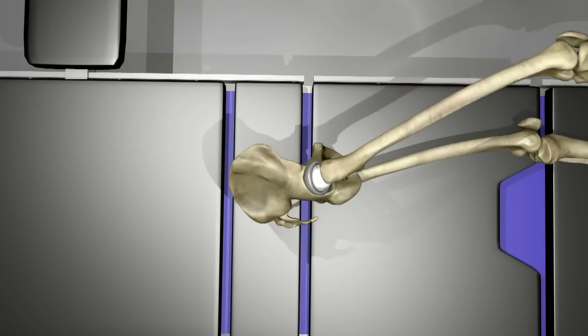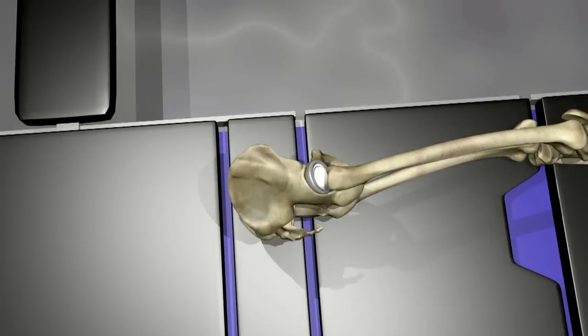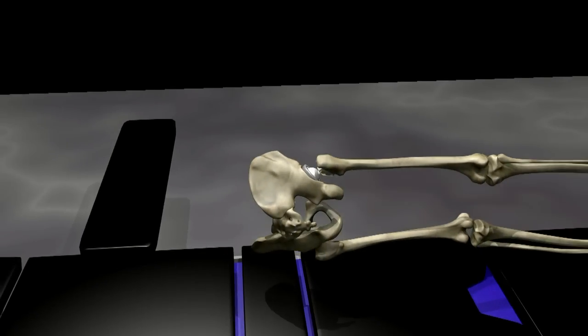The muscles surrounding the hip are repaired with sutures. The skin can now be closed with sutures or staples.